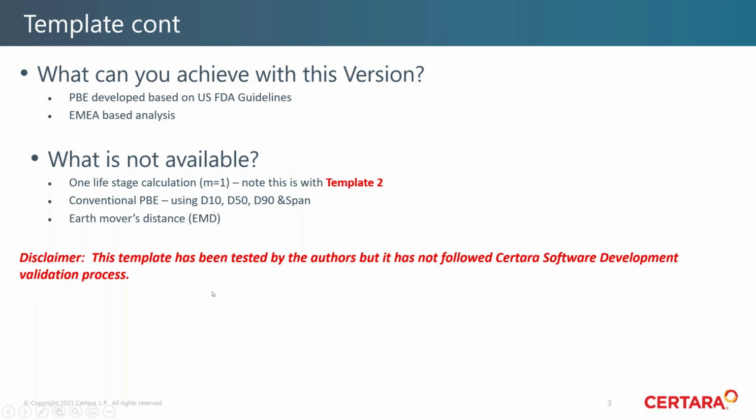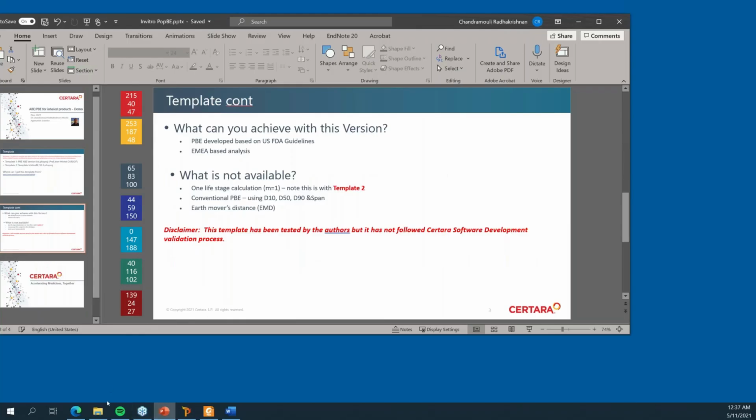And again, I need to point out that this template has been tested by the authors, and it does not follow Certara's software development validation process. You could use this software for your calculation. We are in the process of making it more precise and even better than what we have at the moment. Having said that, I'm just going to move on to Phoenix.